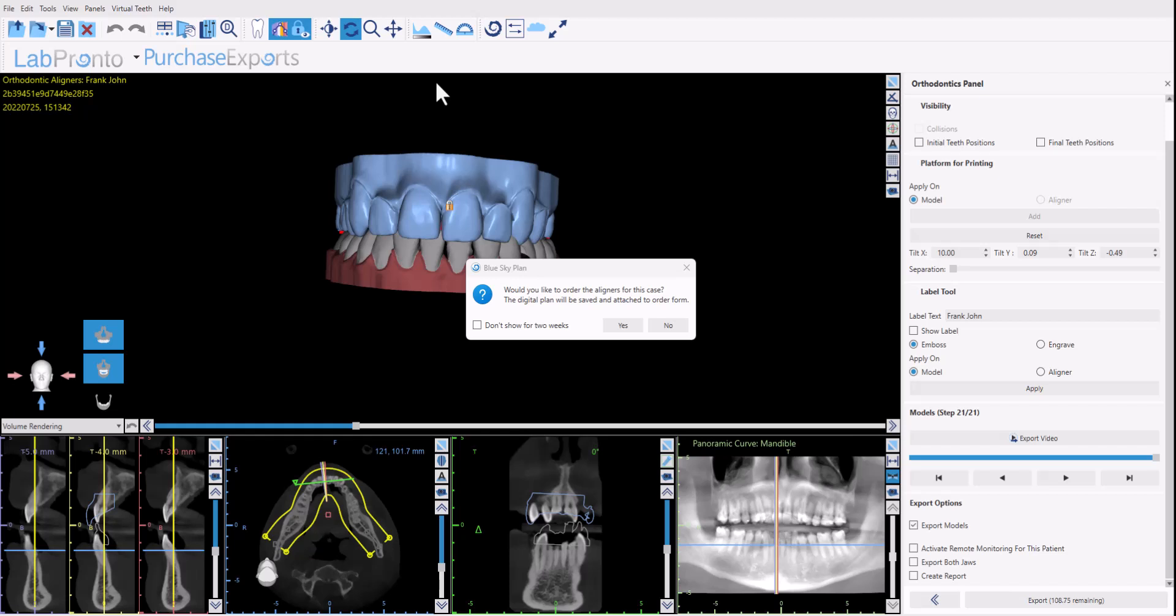So the software now asks would you like to order the aligners for this case? The digital plan will be saved and attached to the order form. If you are going to be manufacturing the aligners in-house then just click no. If you're not going to be manufacturing the aligners in-house, you don't have the equipment yet, you're not set up, then you could click yes.